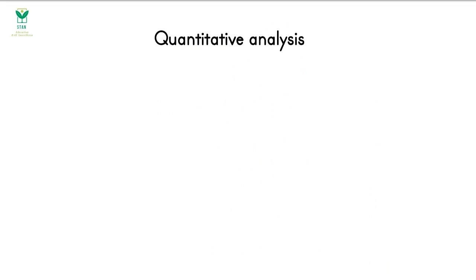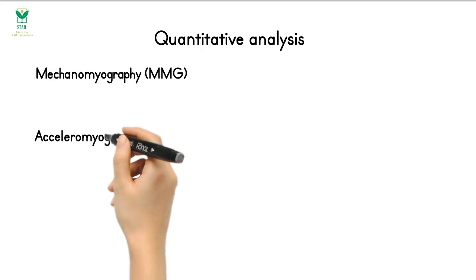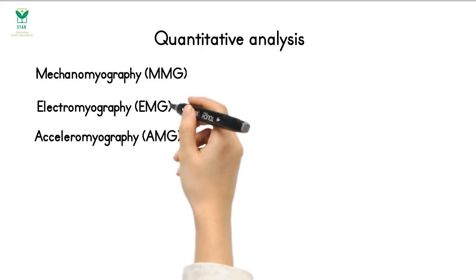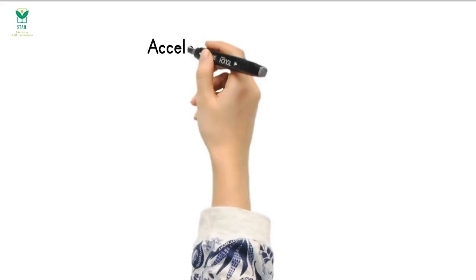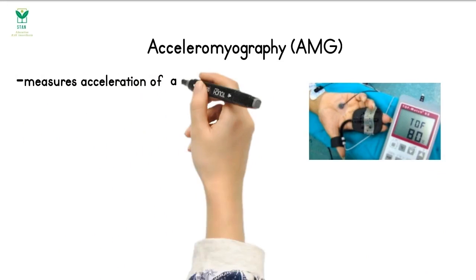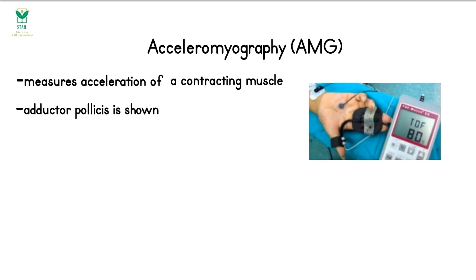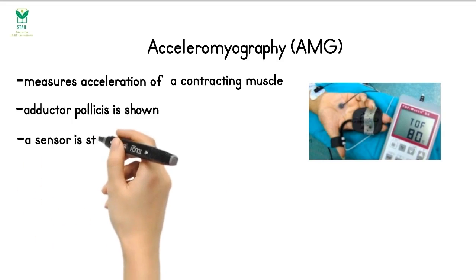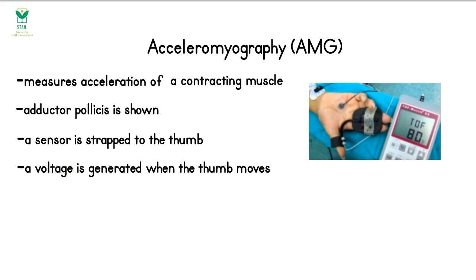There are 3 modes of quantitative analysis of muscle force of contraction: mechanomyography, electromyography, and acceleromyography. The only one in routine clinical use is AMG, and it's the only one I'll describe. Acceleromyography measures the acceleration of a contracting muscle, in this case the adductor pollicis. The acceleration is directly proportional to the force of contraction. A sensor is strapped to the thumb, which produces a voltage when the thumb moves, which is proportional to the acceleration of the thumb.